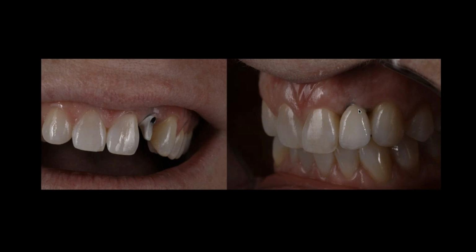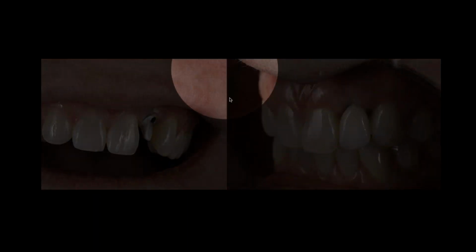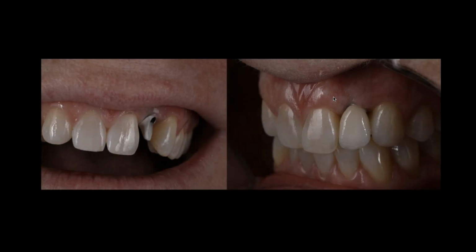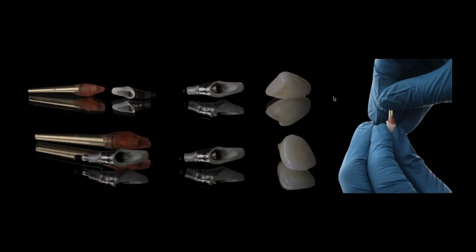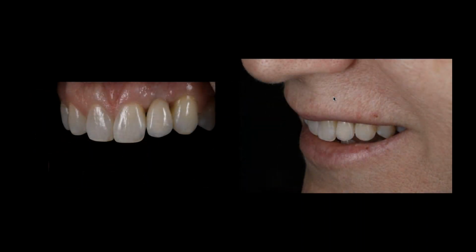So no big deal, but we wanted to make sure that we did that, because we knew that in a big laugh and their most high lip dynamic, the patient would show that marginal integrity. So we had to go back and make that adjustment. I went back and adjusted the abutment, added to the crown, made a new cement jig, and made a new abutment jig, so I could make sure that I was managing that space as best as possible.